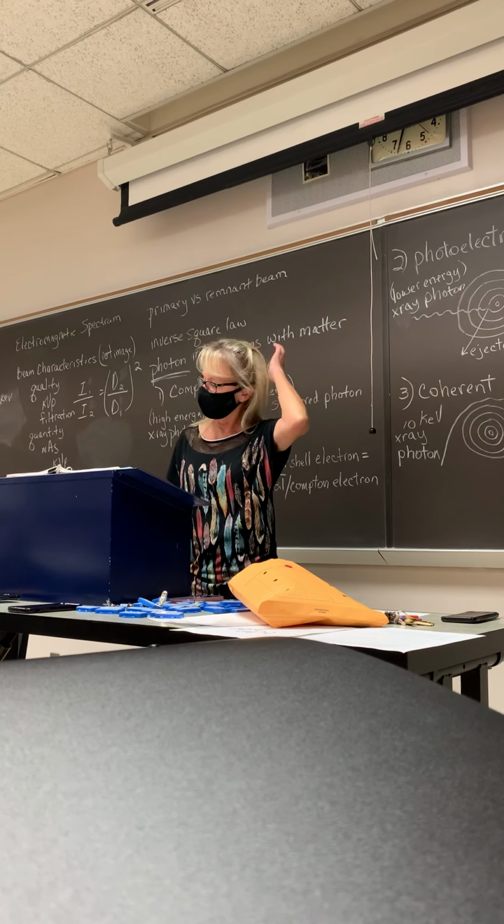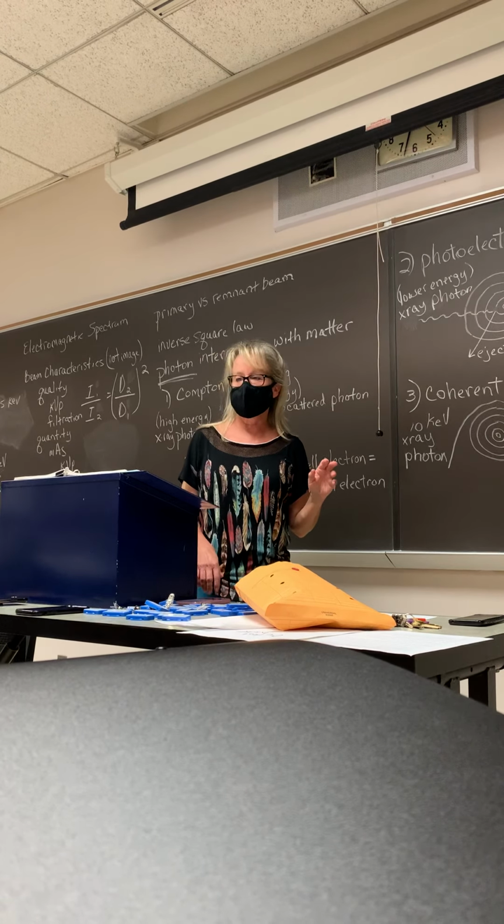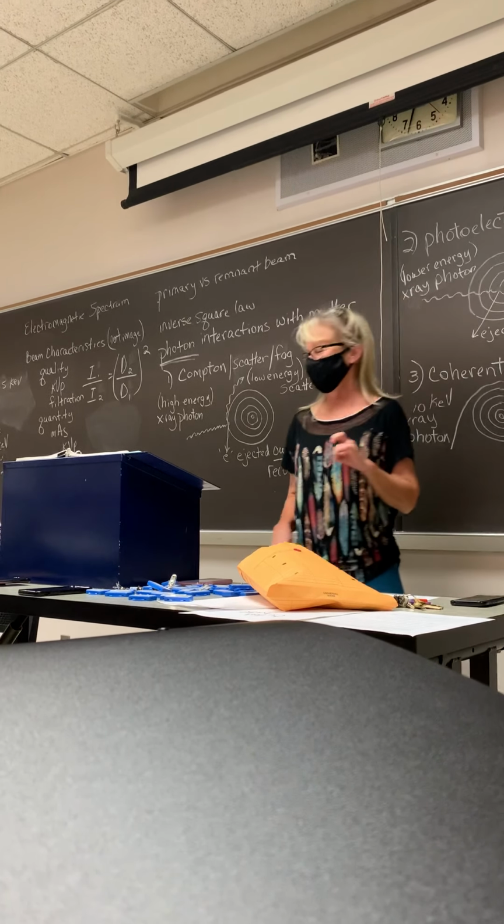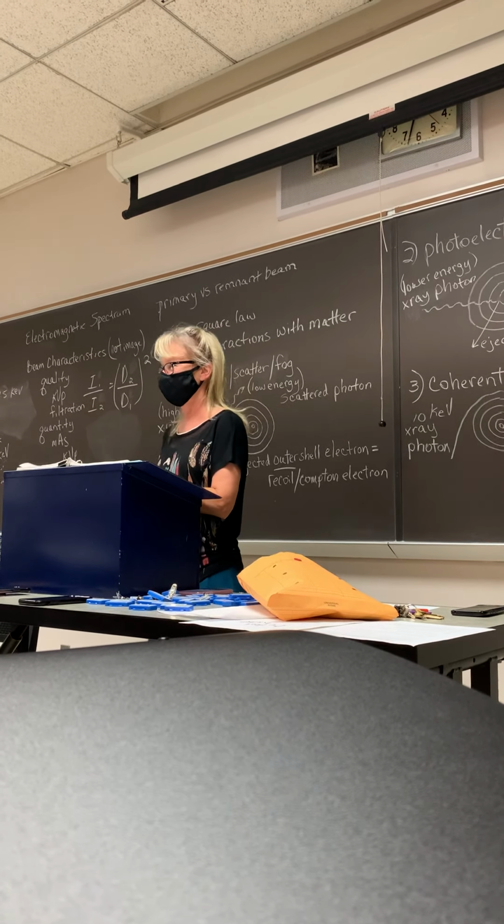All right, exposure switch for fluoro. What's the exposure switch called? Good, a dead man switch. Y'all knew that one.